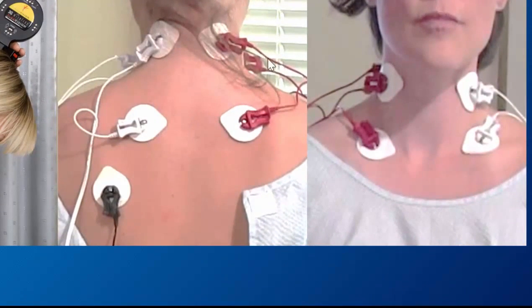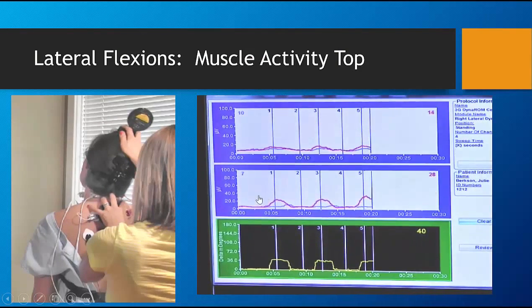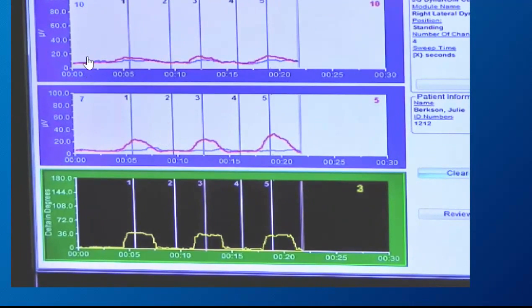For the cervical spine, we're attaching electrodes to the cervical paraspinals and the SCMs. Here you can see we're doing a lateral flexion and we're graphing the range of motion at the bottom, the cervical paraspinals up here at the top, and the SCMs in the center.